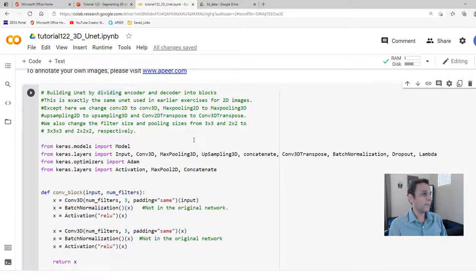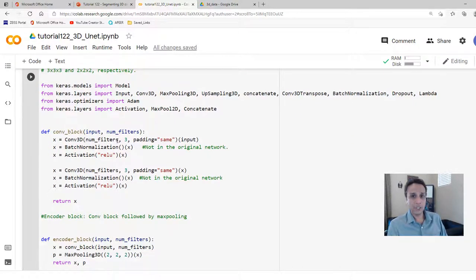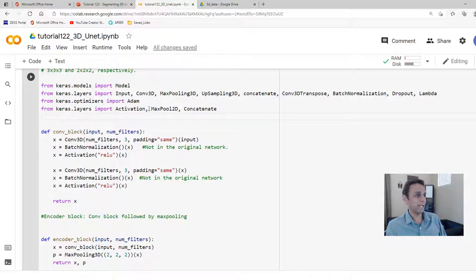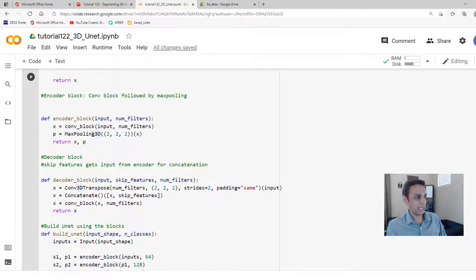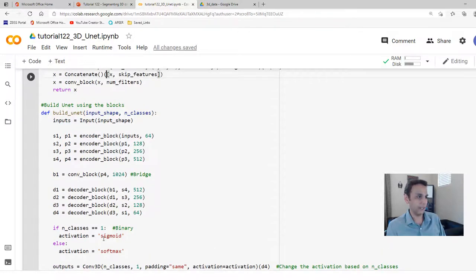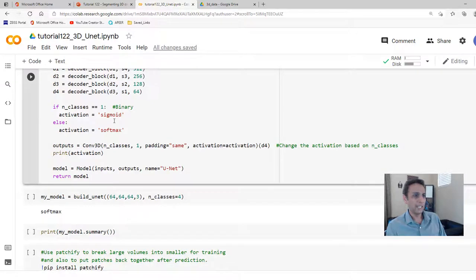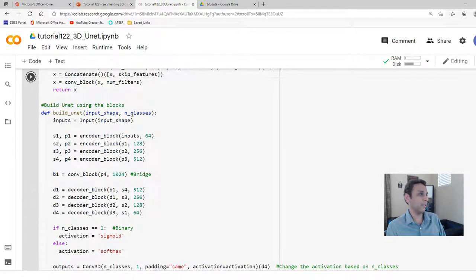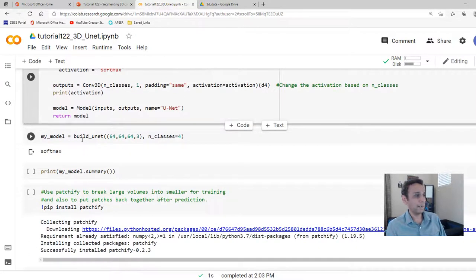The changes I showed you are exactly what I've done in the code. In the convolution block, instead of Conv2D I'm importing Conv3D, MaxPooling3D, UpSampling3D, and Conv3DTranspose. I'm using Conv3D throughout, MaxPooling3D with 2×2×2, and Conv3DTranspose. The rest — number of filters, activation functions — is exactly the same as before. Let's run these and move down to build the model.